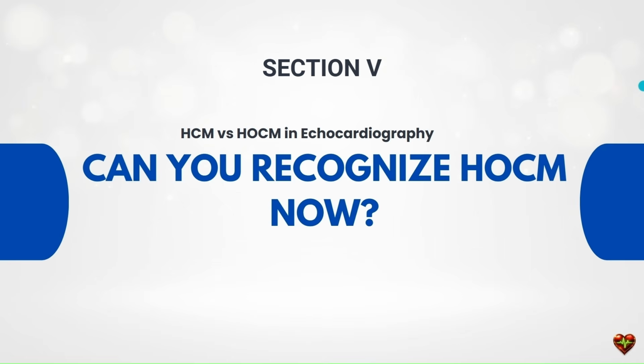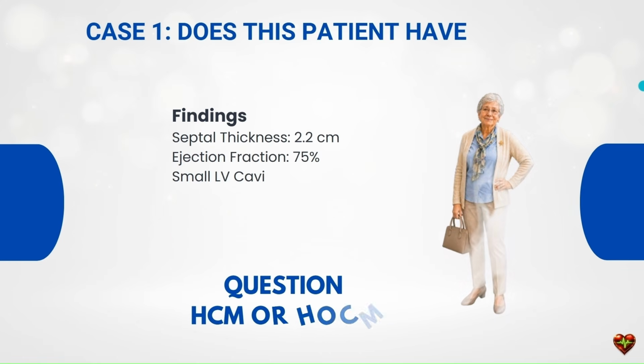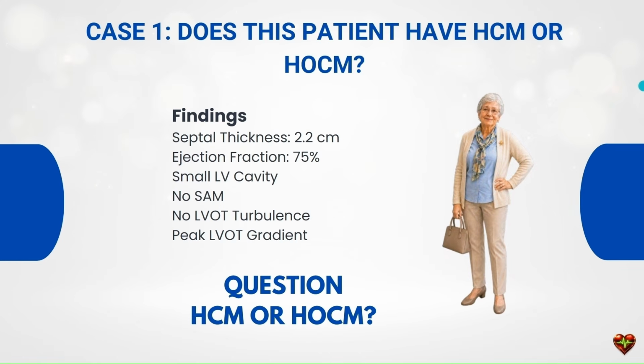Remember, we've covered anatomy, we've discussed physiology, we've learned how obstruction develops. We've built a systematic approach to examination. Now comes the most important part. Can we apply it? Let's see. I want you to approach this patient exactly the way we've discussed throughout this lecture.